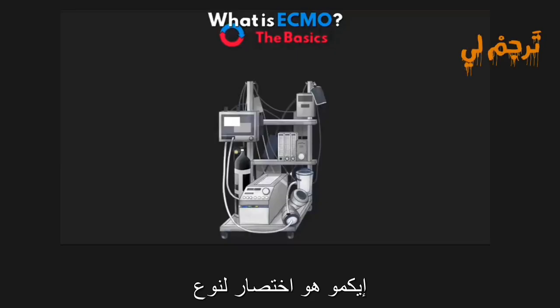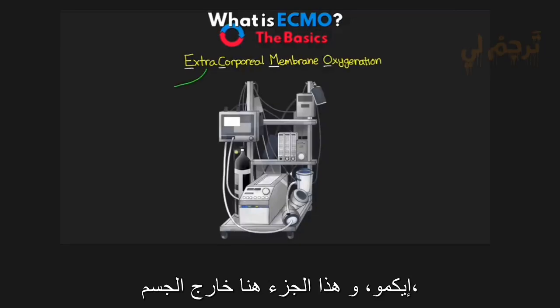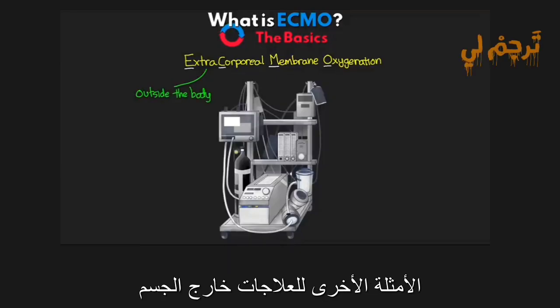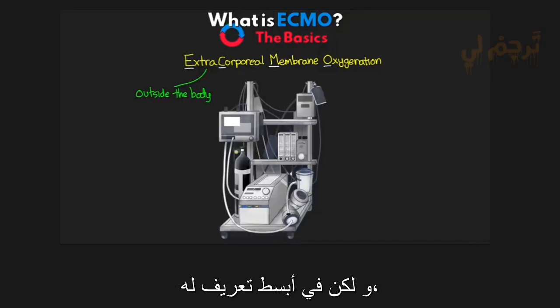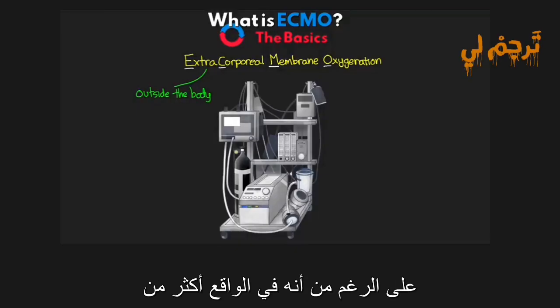ECMO is an acronym that stands for a type of life support that we call extracorporeal membrane oxygenation, ECMO. And this part here, extracorporeal, this means outside the body. Now, other examples of extracorporeal therapies would be things like hemodialysis, as well as some ventricular assist devices. But in its most basic definition, ECMO is oxygenating blood via a membrane oxygenator that's outside the patient's body. In reality, though, it is much more than just that.